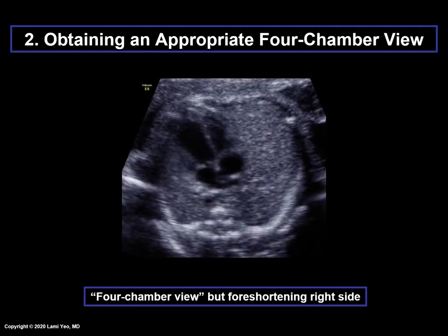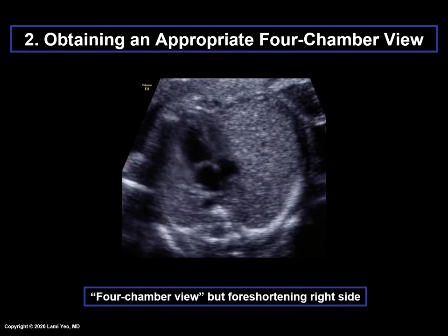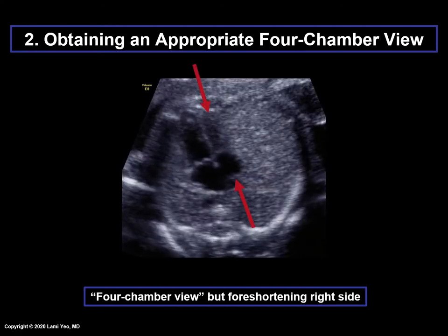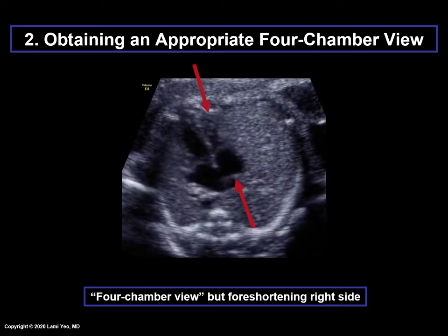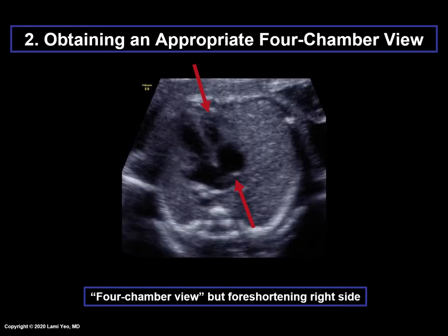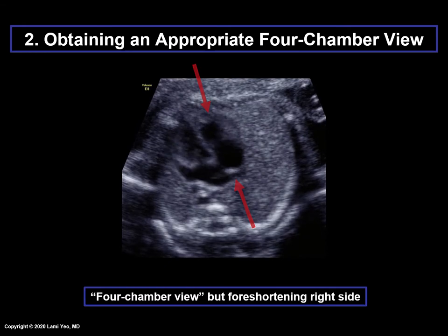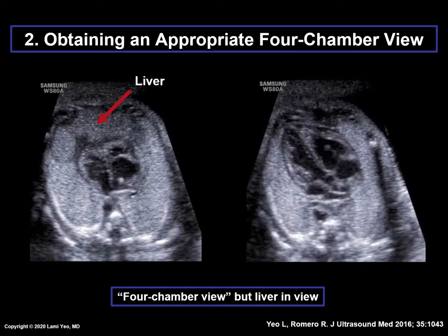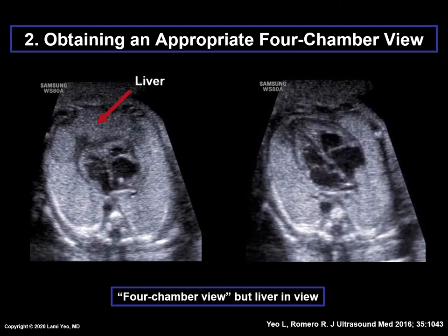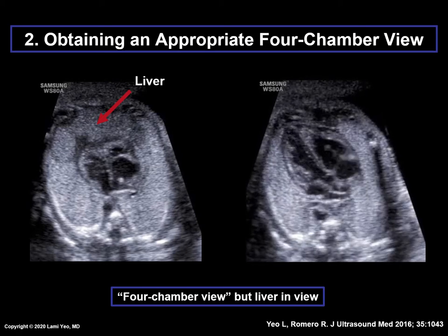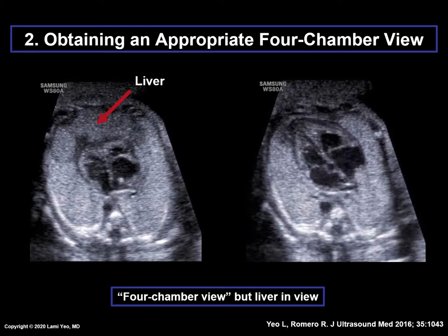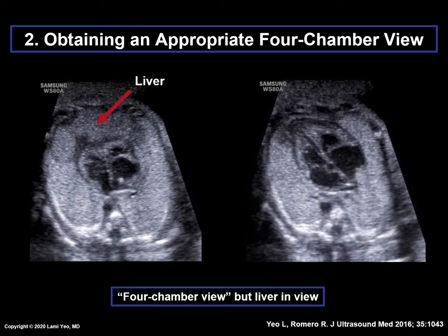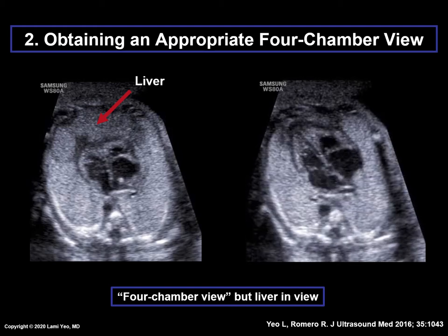For this four-chamber view, the transducer has been tilted so that there is foreshortening of the right side of the heart. If any portion of the fetal liver or stomach is seen in the four-chamber view plane, this means that the transverse plane of the fetal chest is actually oblique and should be corrected by tilting and readjusting the probe.